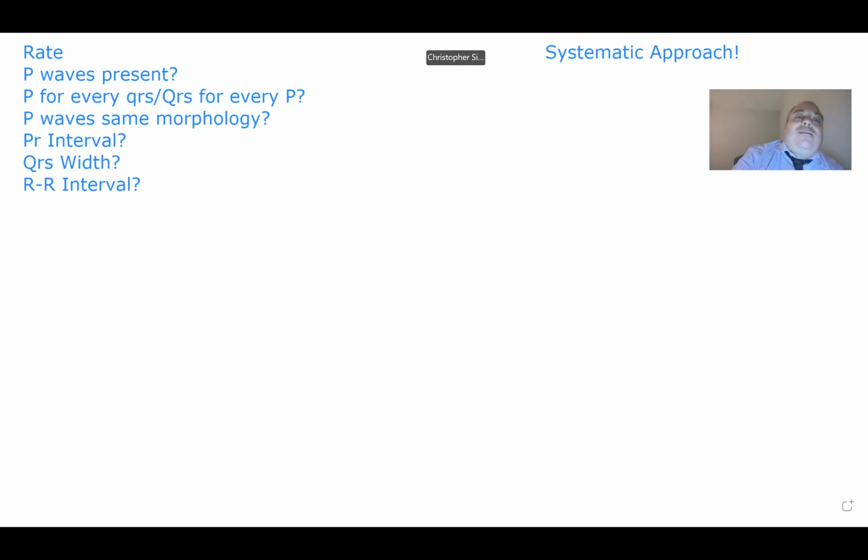We're gonna do one more attempt at drawing it more pretty. And if it doesn't look more pretty, we're just gonna have to go with ugly. Oh, maybe red helps too. So what do we got? P wave, QRS, T. P wave really should be smaller than your T wave.